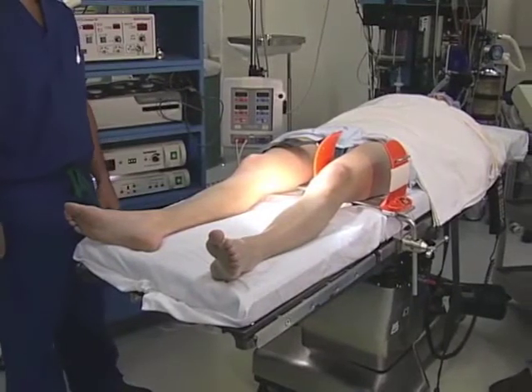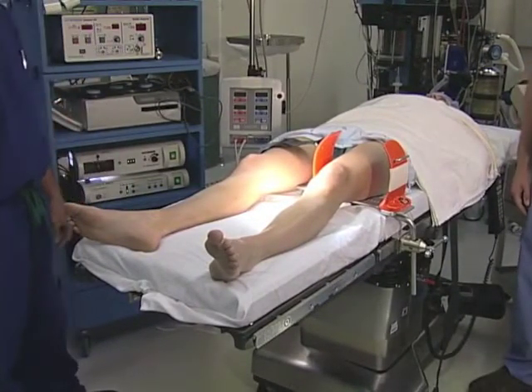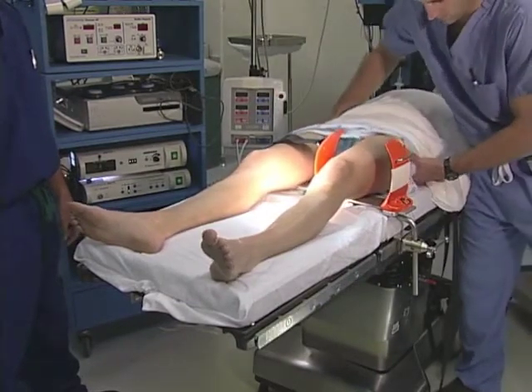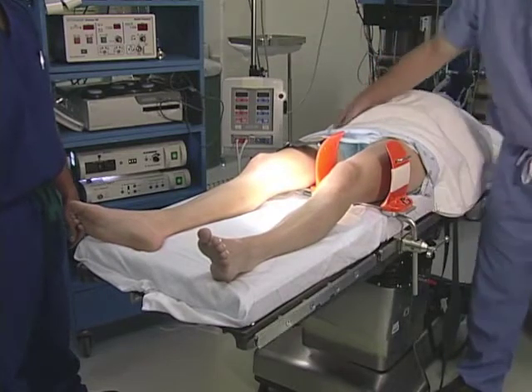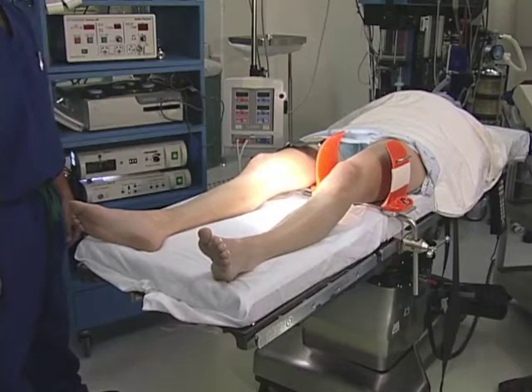The patient is positioned with their heels at the end of the table. We then move their pelvis to the ipsilateral side, the side that you're doing surgery, right to the edge of the bed, which gives us the best leverage for positioning the leg against the leg holder or post.